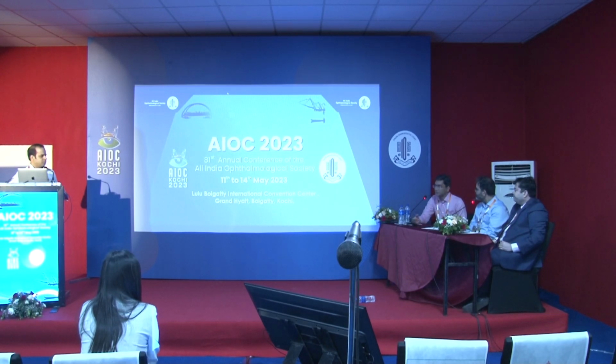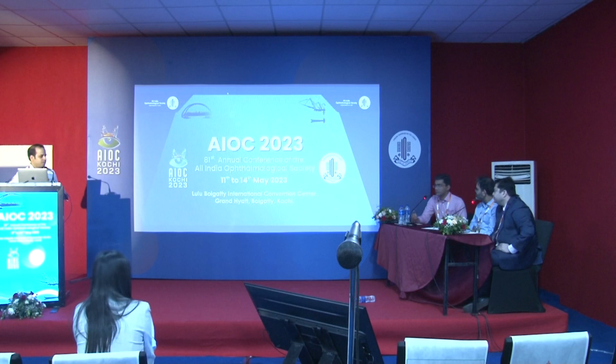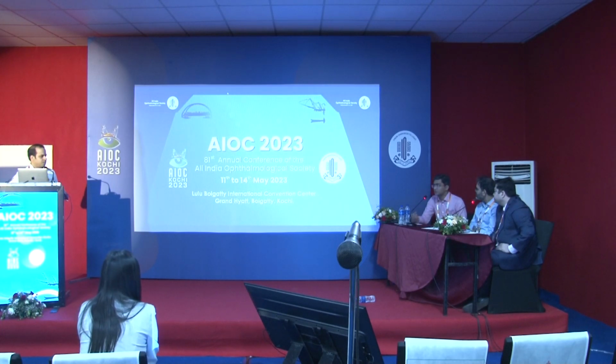Even if the cyst ruptures, the only thing mentioned in the previous literature is a significant vitritis post-op. But right now all the vitrectomy systems are so good that whatever the coagulum is, once it gets dispersed, it's washed out easily. So that is not expected. Even if it ruptures, it doesn't cause any issues. You don't tend to see the vitritis. That's true, yeah.